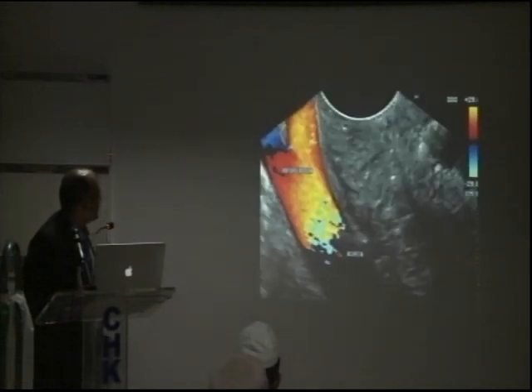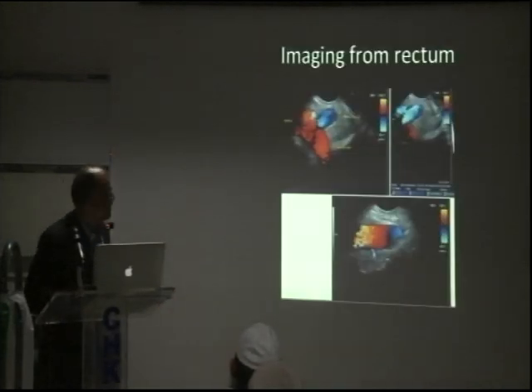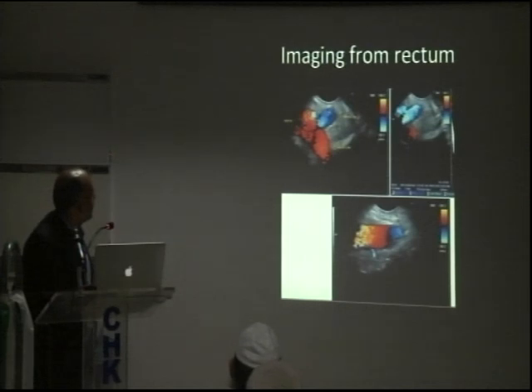All right, anybody? This view is from? We haven't talked about anything, Doctor. No. This is coming from here, this is coming from here, this is the aorta, and nothing else is around here. This is actually from the rectum. All right. Okay. So, this is.